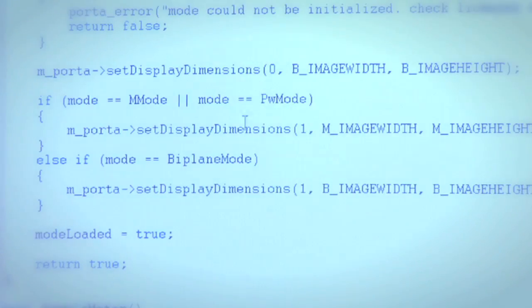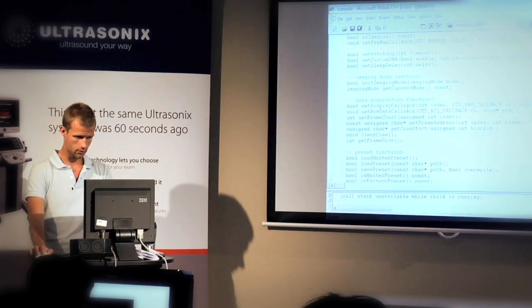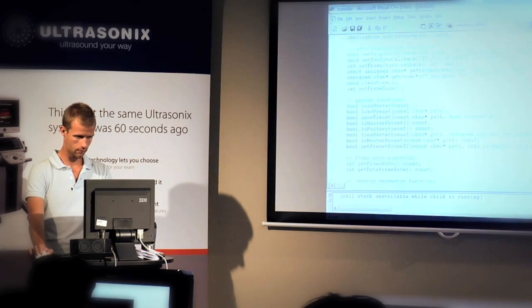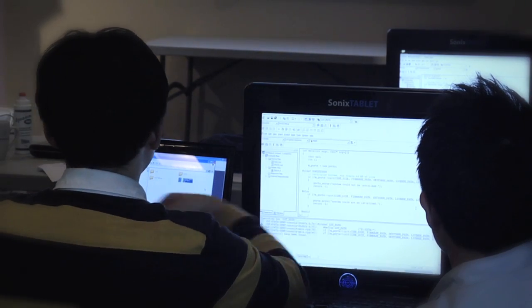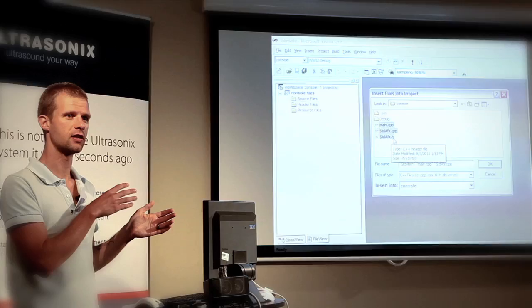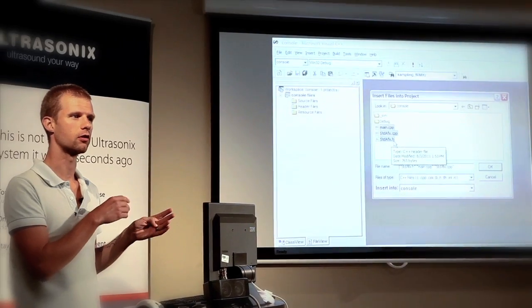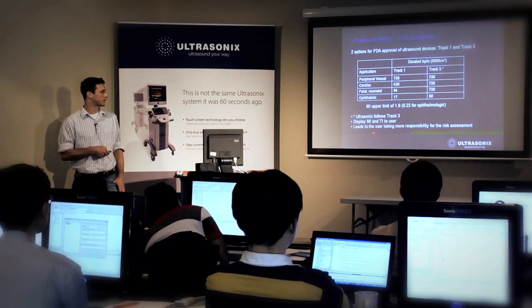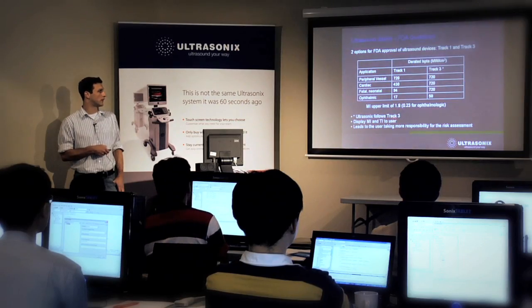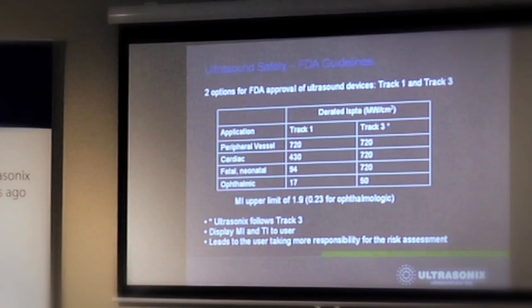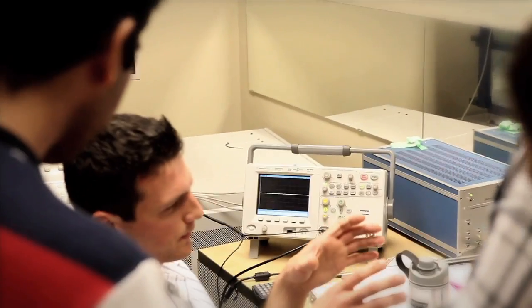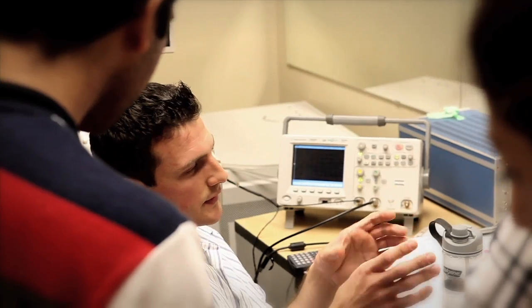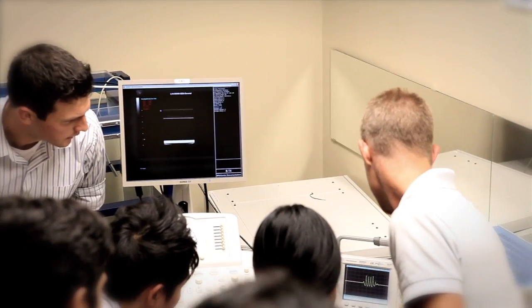Let's look at the prototype for this function. We need an output buffer to process our data, so we set display dimensions. Here at Ultrasonics, we follow the Track 3 guidelines, so you'll see the displays for mechanical and thermal indices depending on the mode used.